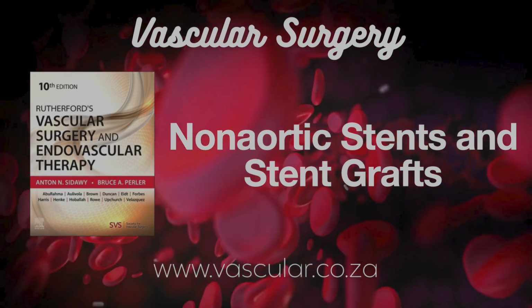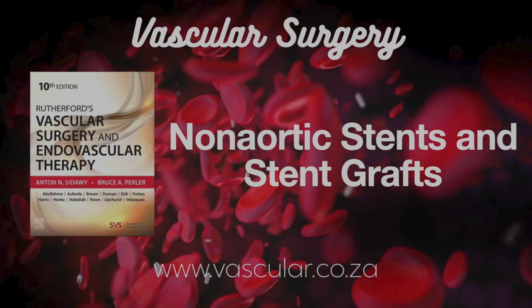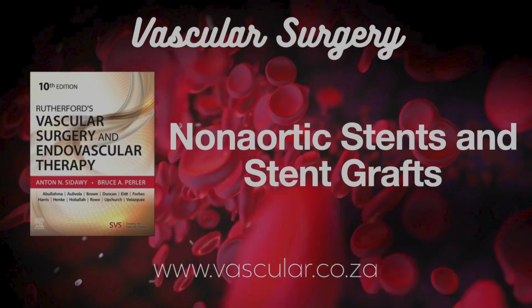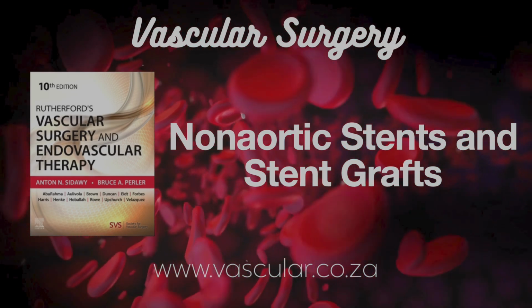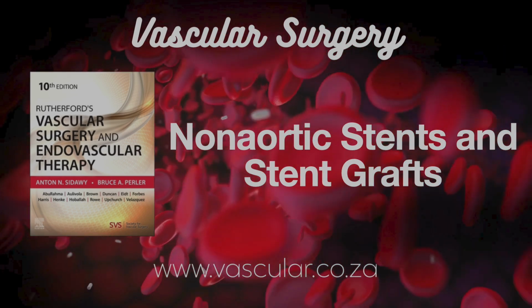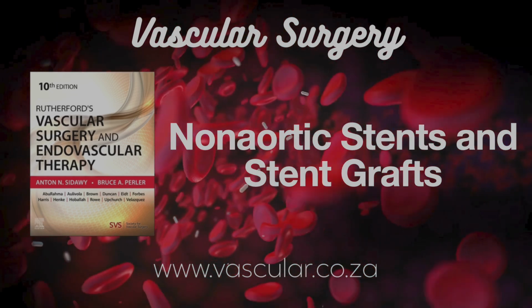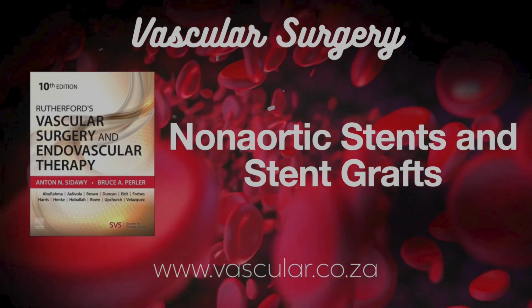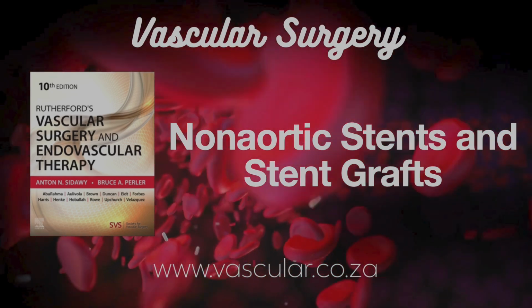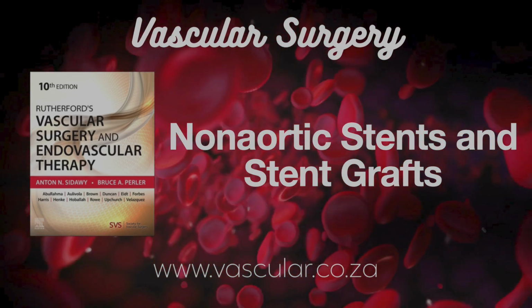And while a clot in a leg stent is bad, a clot in a coronary stent can be catastrophic, right? So the stakes differ. How have DES performed in peripheral arteries, like the legs? It's been more mixed. Initial studies in the SFA didn't show a huge benefit over bare metal stents. Some newer paclitaxel-coated stents looked better, but then that meta-analysis raised safety concerns about paclitaxel, suggesting a possible link to increased mortality. Has that been resolved? Subsequent studies have cast doubt on that finding, but it definitely led to more caution. The chapter stresses discussing potential risks with patients.